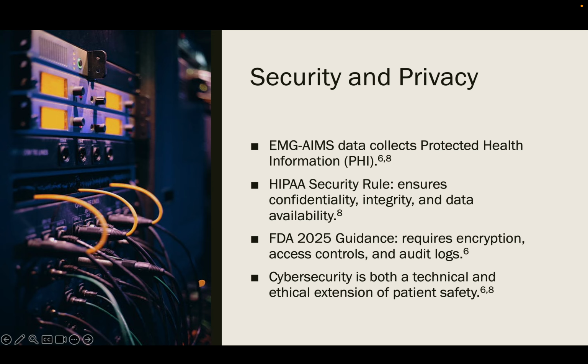The FDA's 2025 cybersecurity guidance further recognizes anesthesia monitors as connected medical devices that must use encryption, user authentication, and audit trails to prevent unauthorized access. These safeguards are an ethical extension of patient safety, protecting digital data and ensuring that quantitative readings remain accurate and reliable for post operative review, preserving both patient confidentiality and clinical accountability.